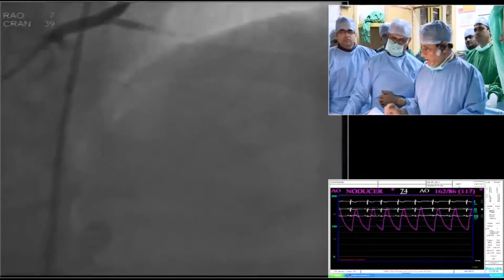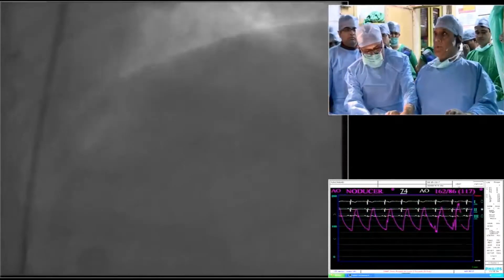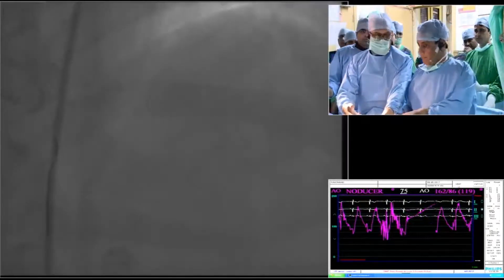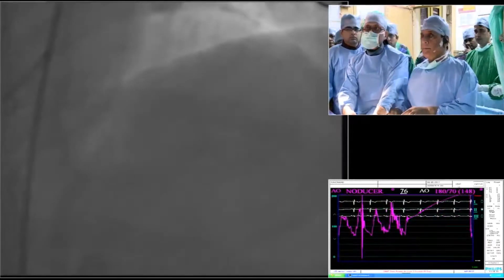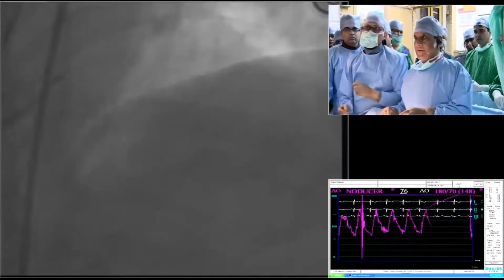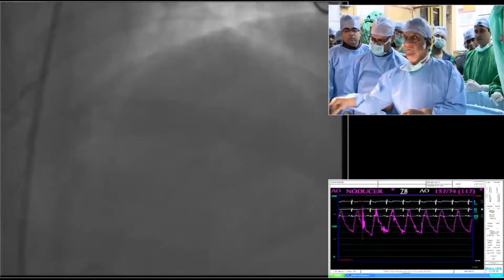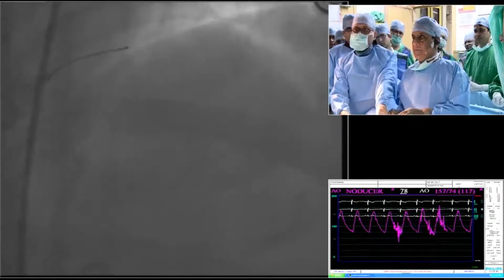And this is what we have planned. We have engaged — it's a six-French guide, EBU. And the plan today is to revascularize with the wire first, then decide which stent. But we actually have the Miras available for this particular case.